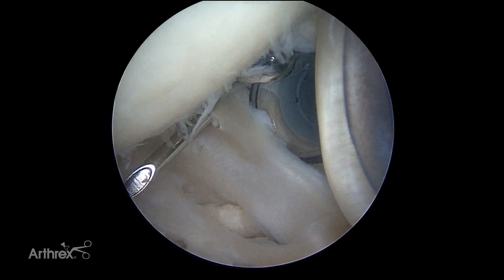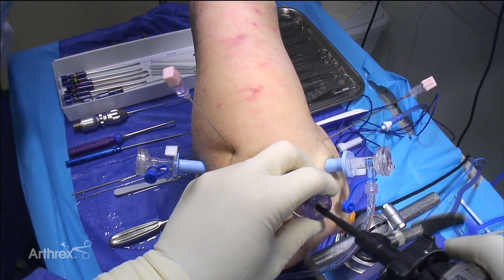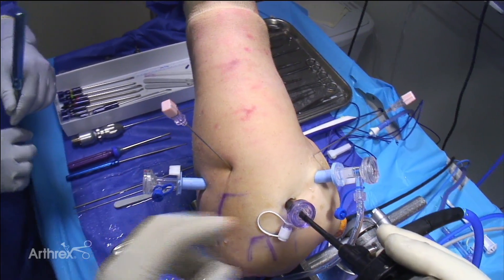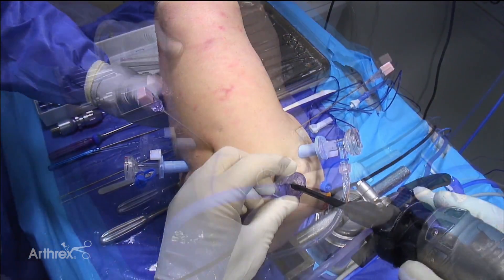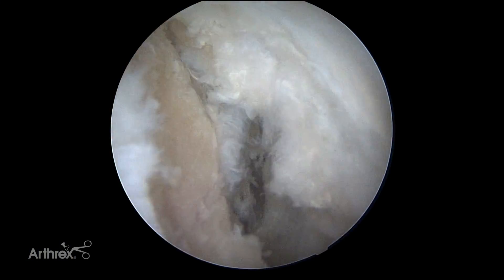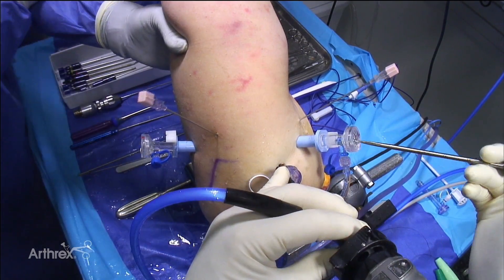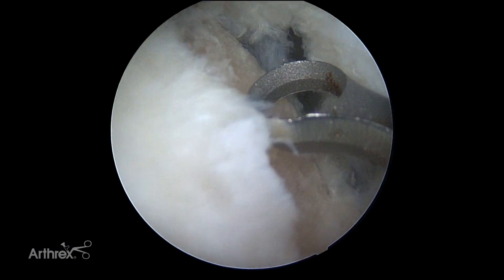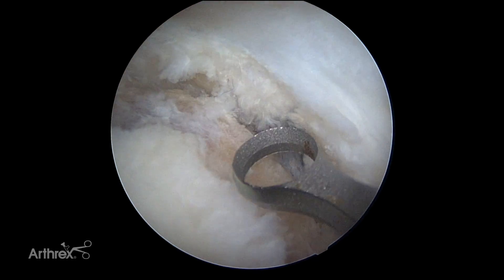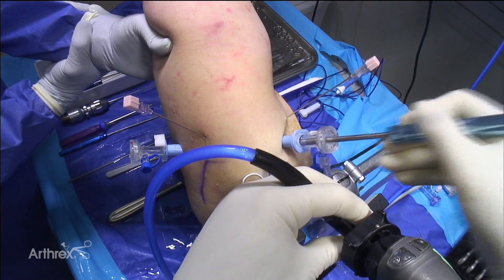Here is our Gemini cannula in the front — very useful in these instability cases. This is a sheathless arthroscope that's more rigid; for instabilities I'll put my three cannulas in and just switch my scope from one to another without changing sheaths or using a switching stick. I've done the prep already, but you want to get all those fibrous bands off so you're all the way down to the subscap muscle belly — that allows your labrum to float up to the level of the glenoid. Sometimes articular cartilage overhangs the edge of the corner, so I'll take a little time to remove that excess, even creating a small two millimeter track toward the face of the glenoid.